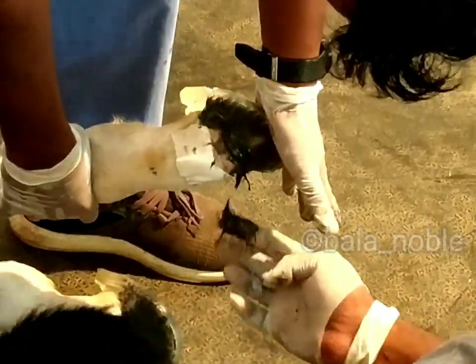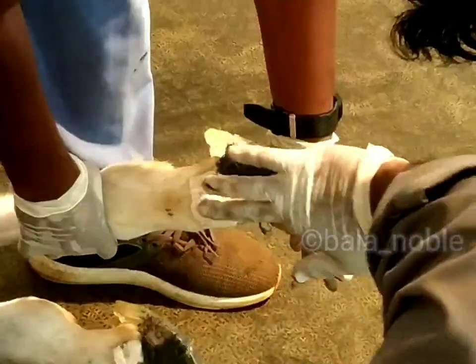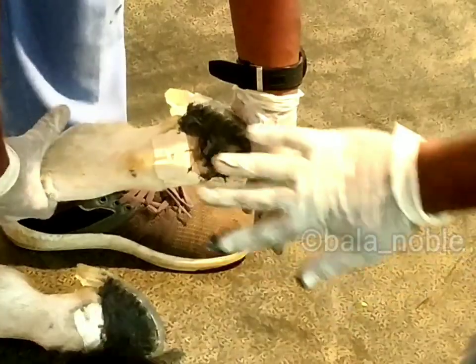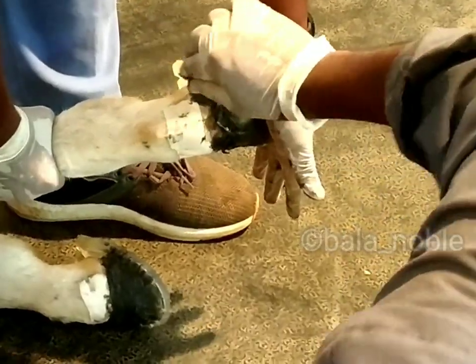We applied the adhesive plaster over the coronet region, so that the glue will not stick onto the coronet area. After applying, just keep it for 5 to 10 minutes and the material will get hardened.